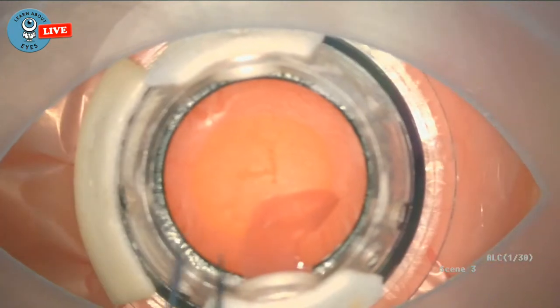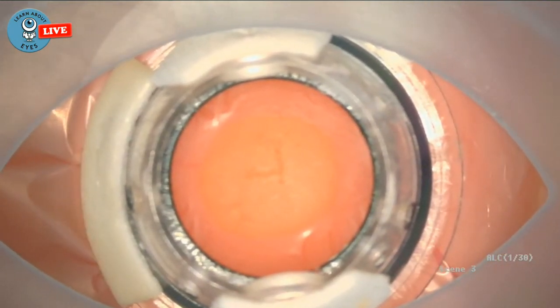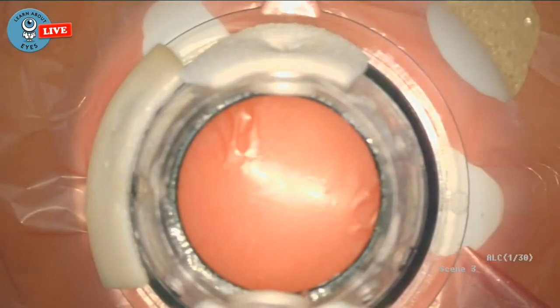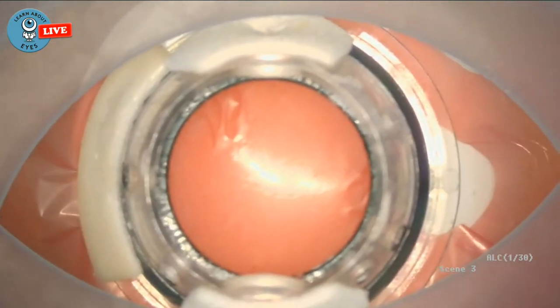But I mean, it's cool not to have to actually use that needle. It's cool to just use one instrument, one thing less that you need to throw away after. Okay, let's do one more like that and then go to the phaco part. If there's any tips and questions in the meantime, just tell me.